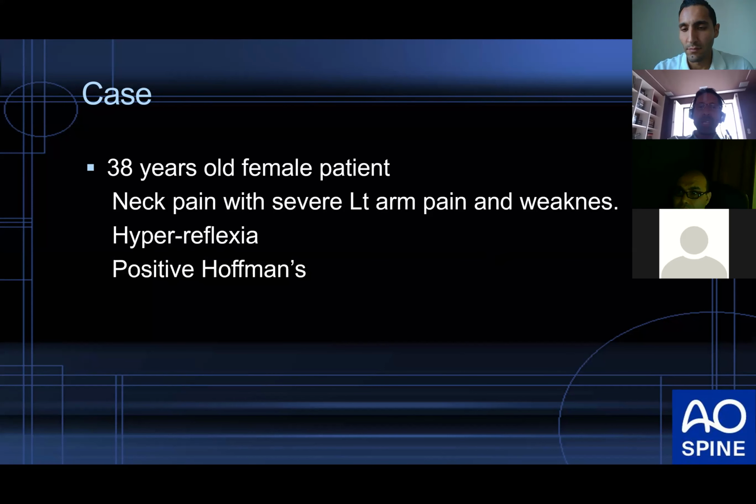This was really a very selected case in which we dared to do the operation. We had a very good result, and we were, in a way, happy to see that the disc prosthesis itself offers some limitation to hypermobility. This was just to challenge the concept, nothing else. During my presentation, I said that this cannot be applied on a large scale. I was very clear on that, but thank you again for stressing that.